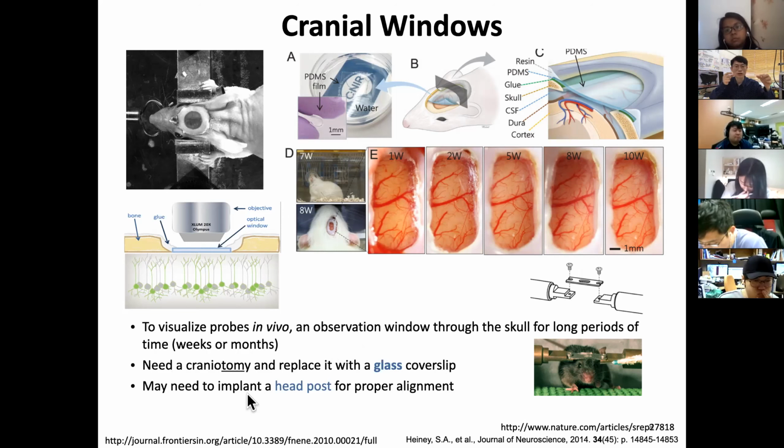Or I was usually interested in observing microvasculature such as capillaries, which have a diameter of about 4 microns. This is tiny, and with this crude setup, forget about it. You can't image. In that case, you need better, really sturdy fixation. You have to think like a mechanical engineer to consider how to make it.